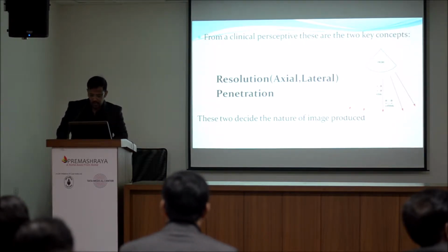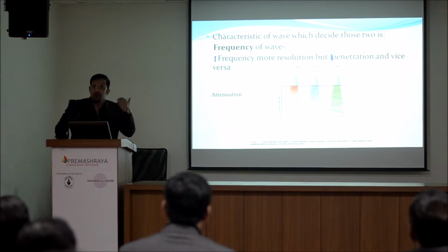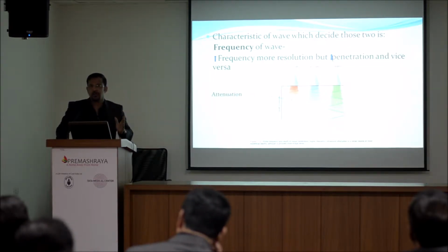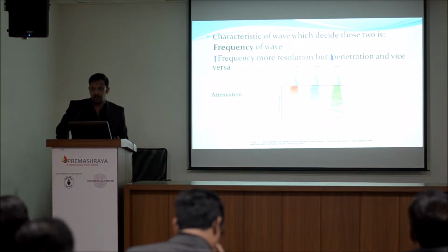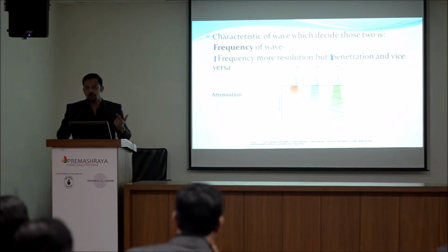These two decide the nature of the image, and this is dependent upon the frequency of the wave which is generated by the probe. The more the frequency, the better the resolution. It means the axial resolution and lateral resolution will be better, but the more the frequency, the less the penetration. So why am I telling this? This decides the nature of the probe which you will select while doing your blocks.